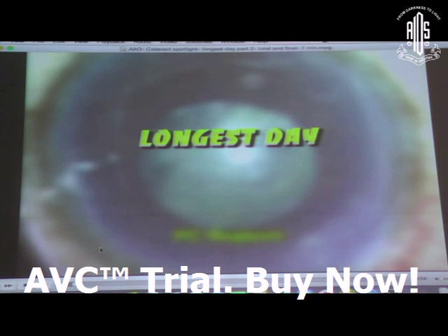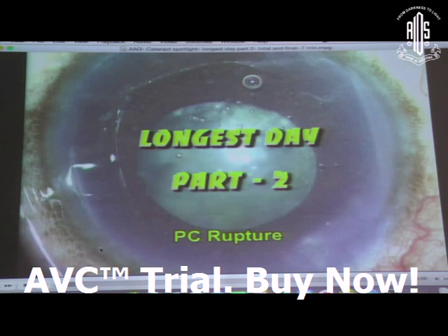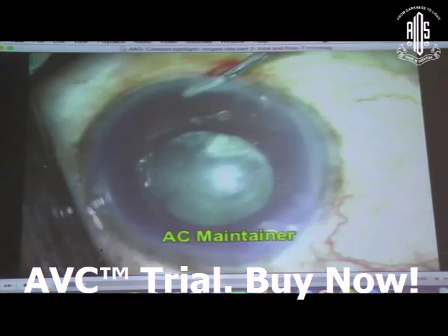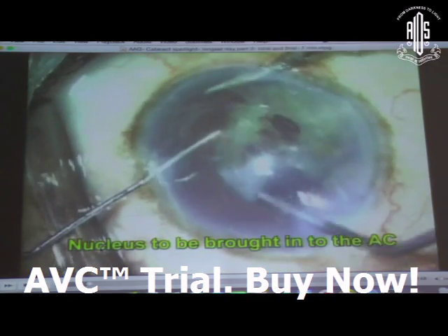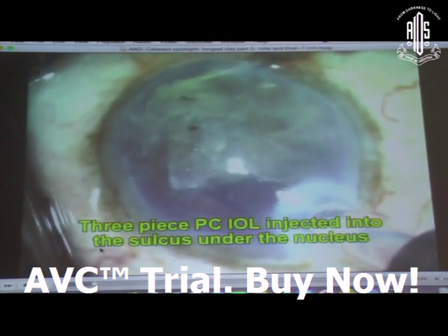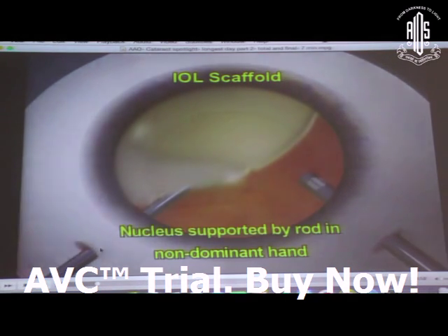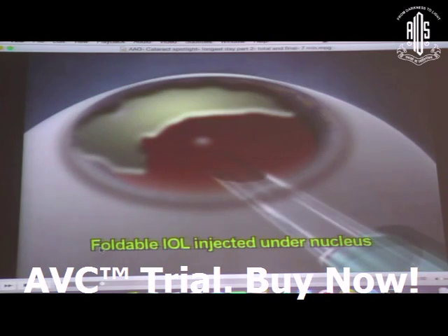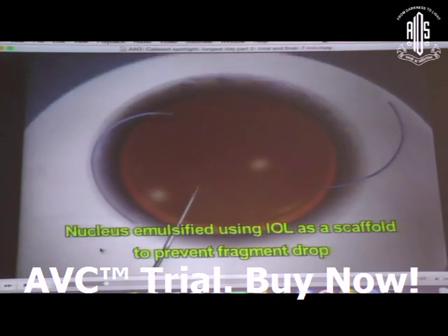Suppose by chance you have got a drop forming because of your femto. Remember one thing, when you do femto, the advice I will give people is when you're removing the air, first remove it carefully. Now look at this case, nothing has happened, but the lens is already sinking without anything happening. So in such cases, just go ahead, and you can see what I'm doing now is, I've just removed that nucleus, brought it up anteriorly, and now we will try to do the scaffold technique to emulsify this nucleus before the fragment goes down fully.